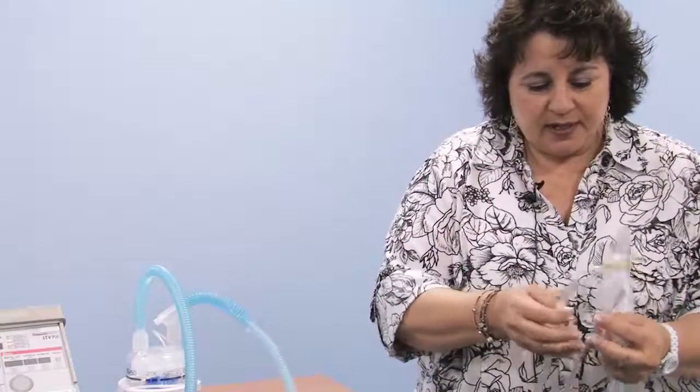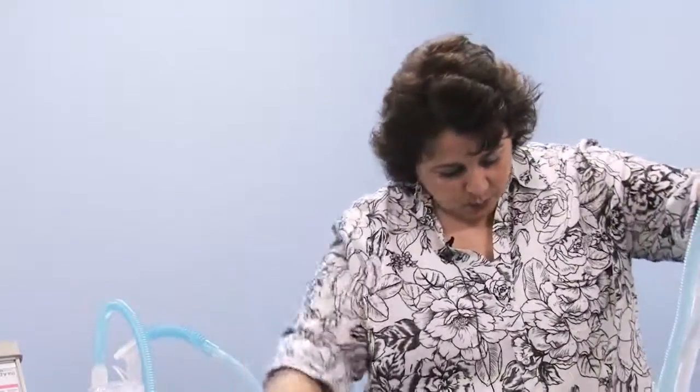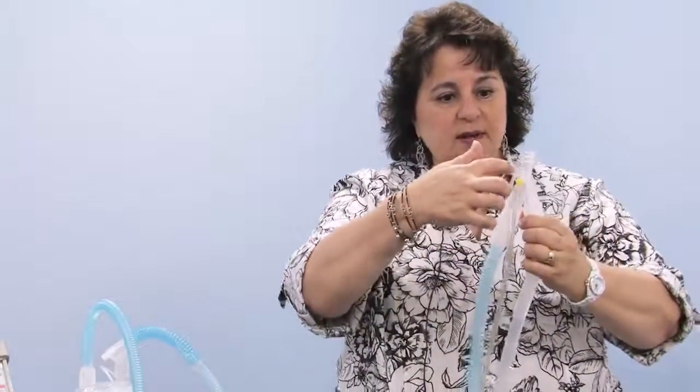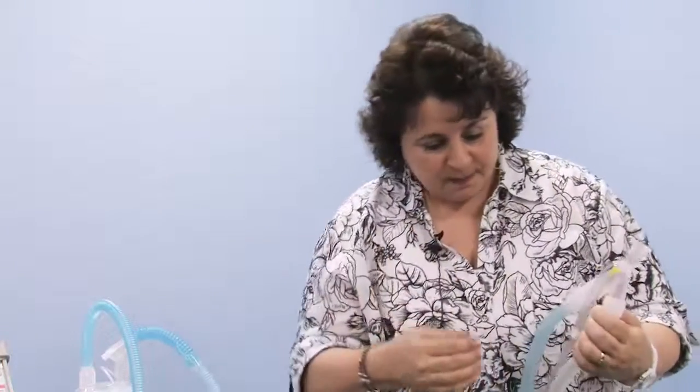And we talked about the 3 different hoses that go onto the side of the ventilator and that are very important. If we follow this one along, it'll lead us to an exhalation valve. So when your child gets a breath from a ventilator, it's delivered in through the blue hose, and fresh gas is always going by here, 10 liters a minute of air. If you're not familiar with that, think about 1 liter of oxygen that comes out of a meter that you provide for your child; 10 liters of air goes constantly by here. So your child just has to breathe a little bit from here to tell these sensors, I want a breath, fire and give me one, please.